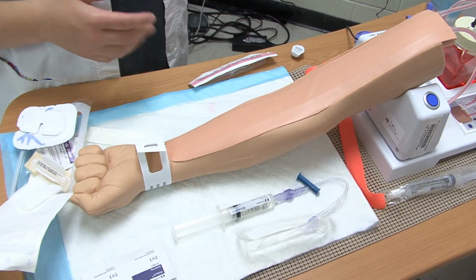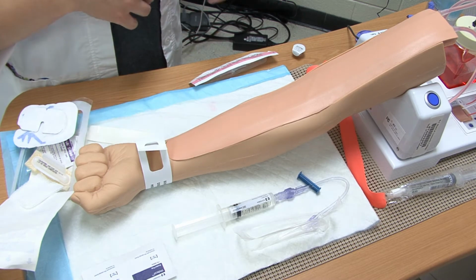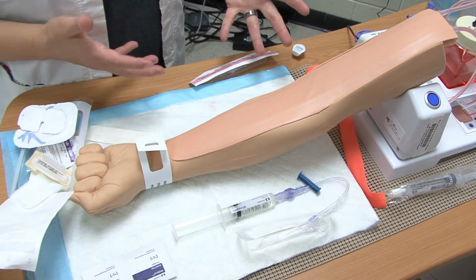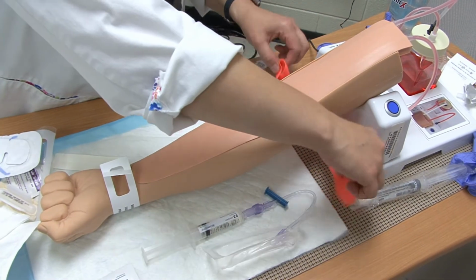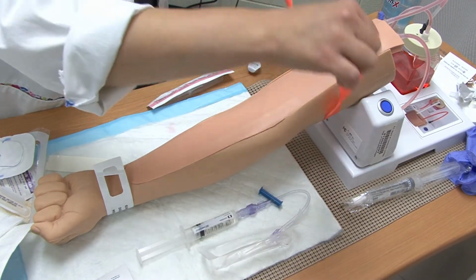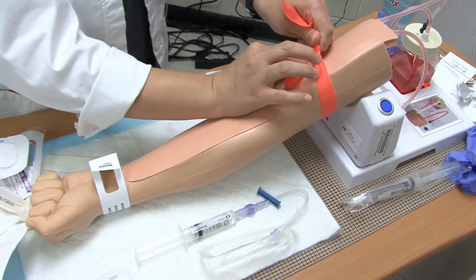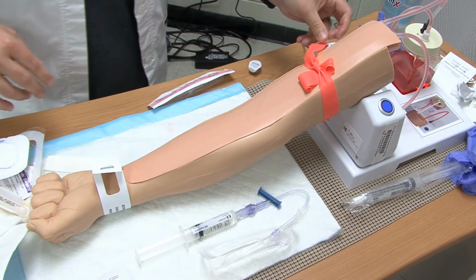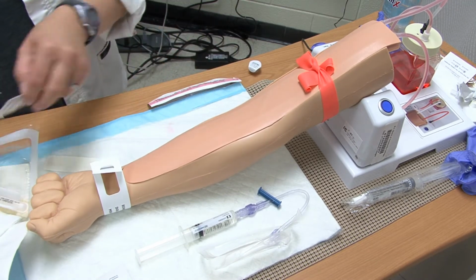When I am ready, I need to come back over here and I need to retie my tourniquet. Again, you don't want to leave it on for more than a minute. And so you might want to actually tie it after you've cleaned. It's up to you, however you do. But I'm going to go ahead and tie the tourniquet now. I'm going to tie 3 to 4 inches above the site that I'm actually going to use. And I'm going to come back over here and I'm going to use my ChloraPrep.